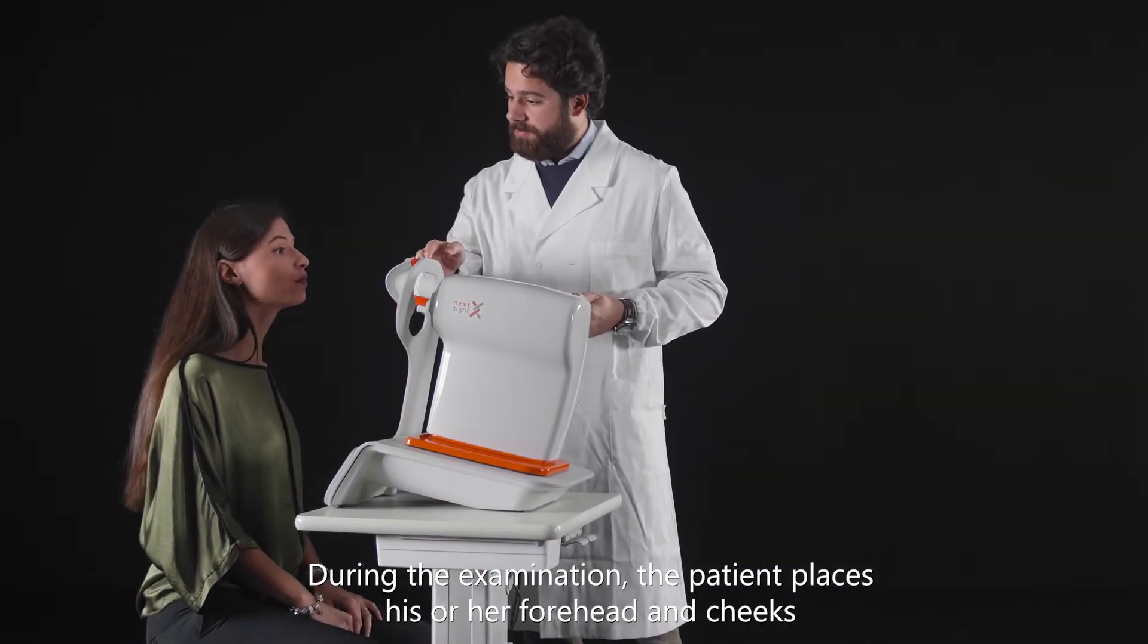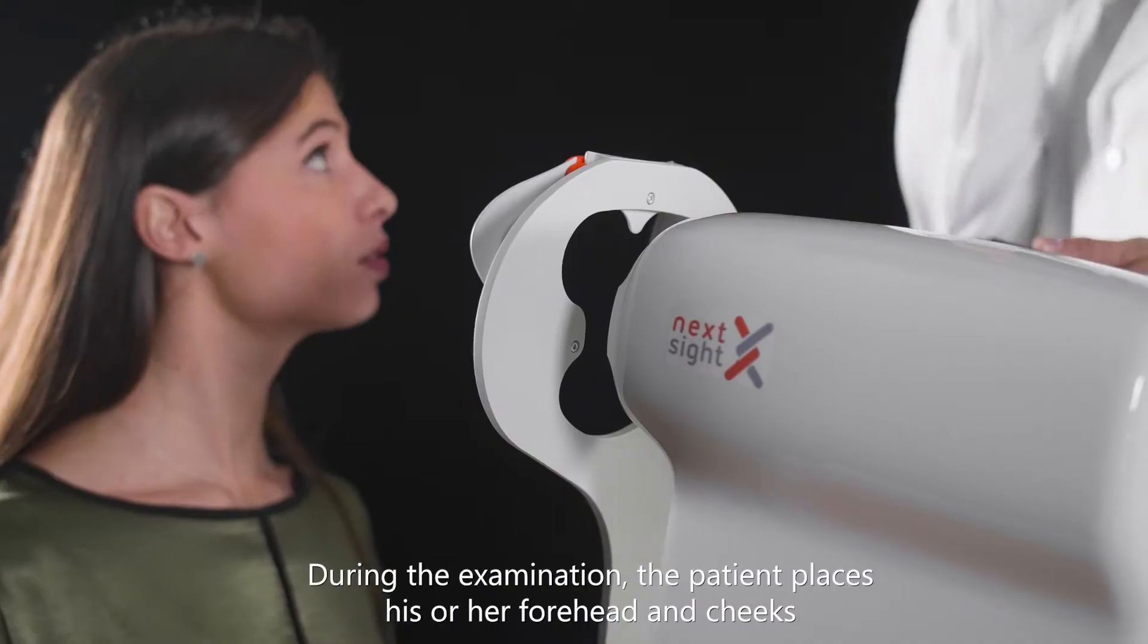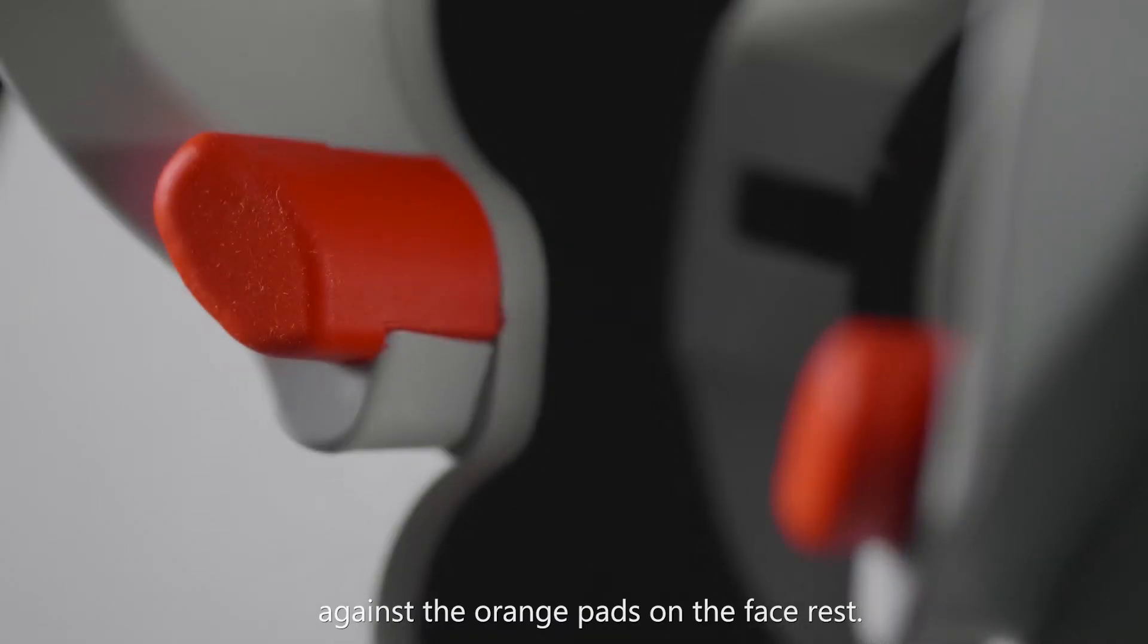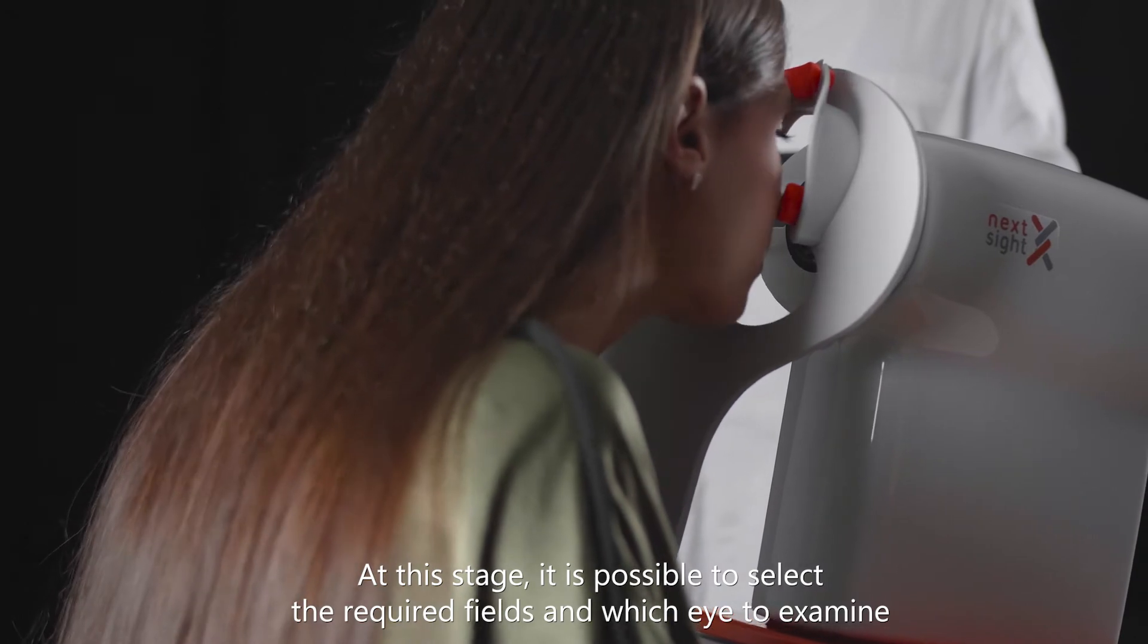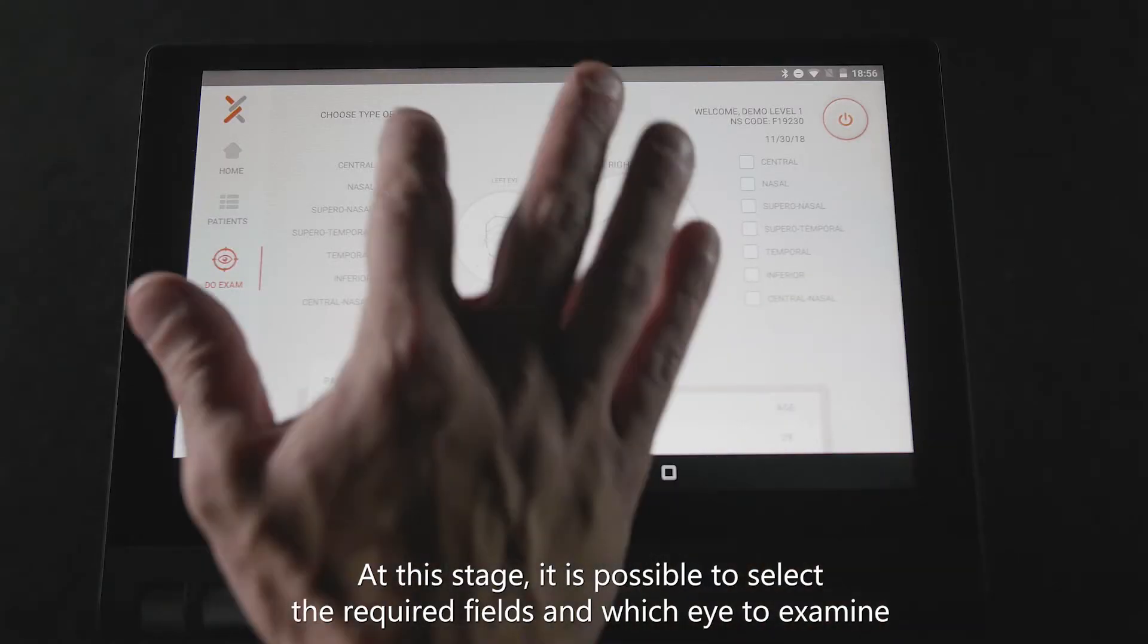During the examination, the patient places his or her forehead and cheeks against the orange pads on the face rest. At this stage, it is possible to select the required fields and which eye to examine.